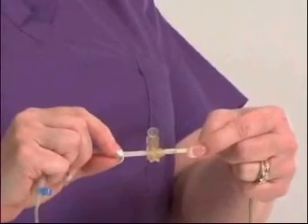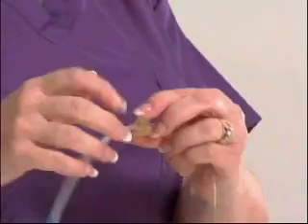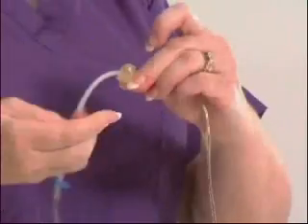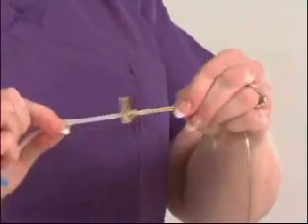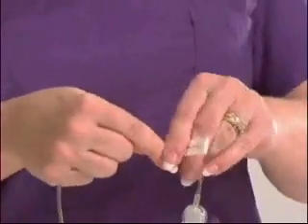Identify the breakaway tab on the administration set. Twist and remove this breakaway tab attached to the yellow flow stop. This will cause a spring in the flow stop to prevent flow from the set. You may also want to close the slide clamp to be safe.